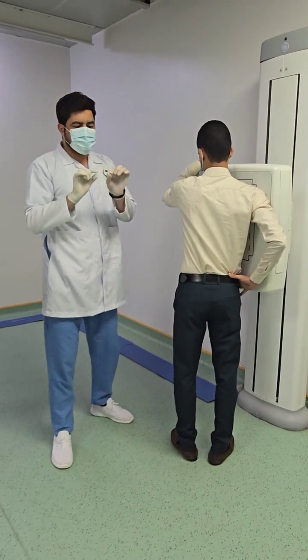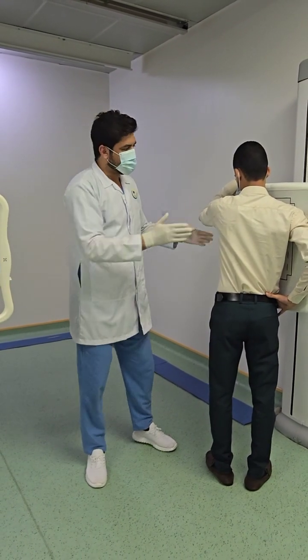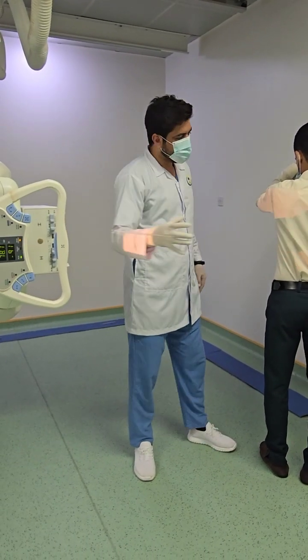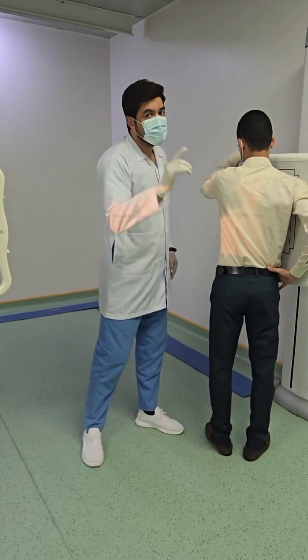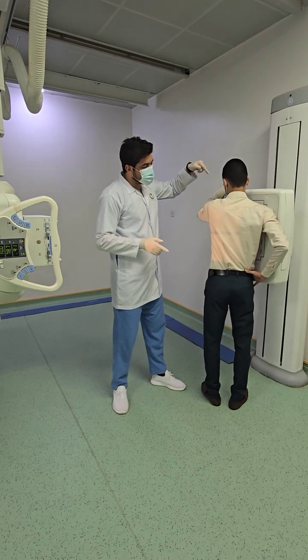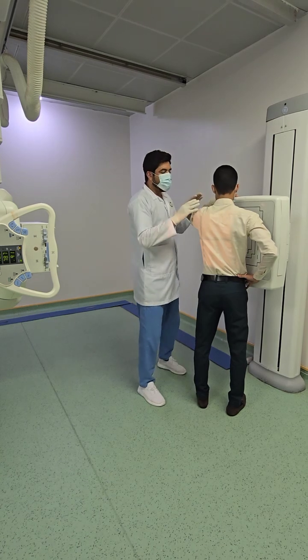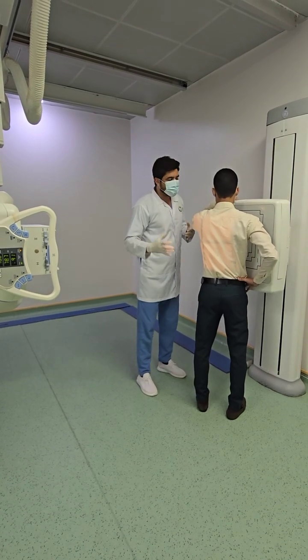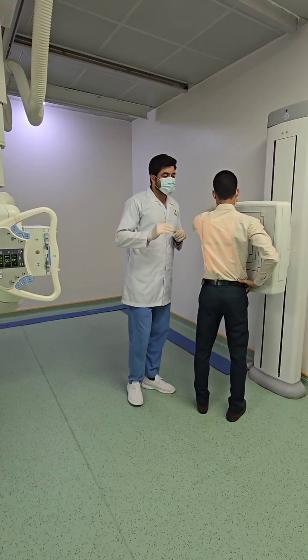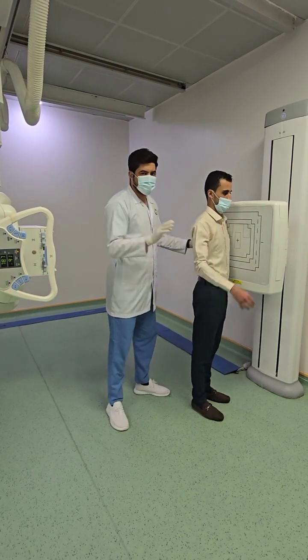You can see oblique is from 0 degrees to 90 degrees. The angle between 0 and 90, you can see over here. The patient is at some angle. The X-ray will come out and interact first at the posterior aspect of the body, but as I told you, in the oblique we will not consider the X-ray tube first. We will consider the detector. It will interact at the posterior aspect of the body, get inside the body, emerge from the anterior aspect of the body, and finally interact with the image receptor. This is the anterior oblique position, the right anterior oblique. Okay, now come to the left anterior oblique. Now, look over here.